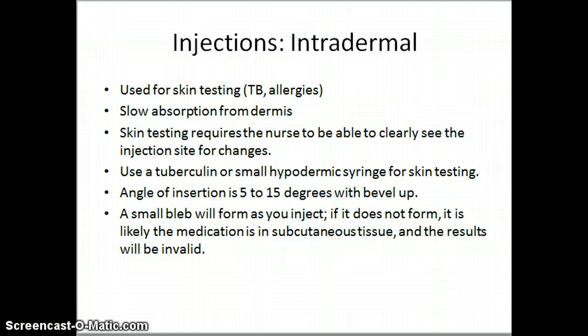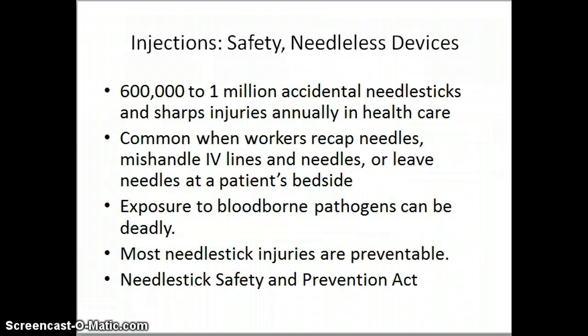If a bleb does not appear, you're probably too deep and you need to withdraw a little bit, or if you are administering it and you are getting medication leaking out of where your injection site is, you'll want to go in just a little bit deeper to ensure that it is down into that area.